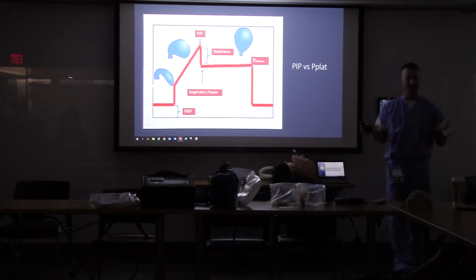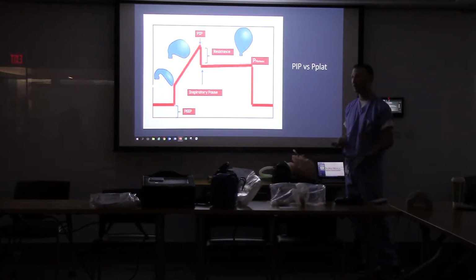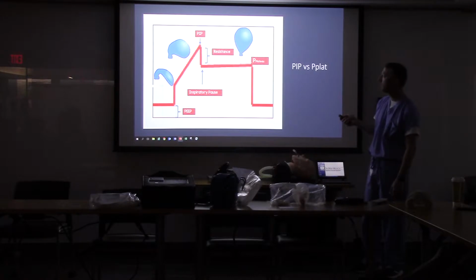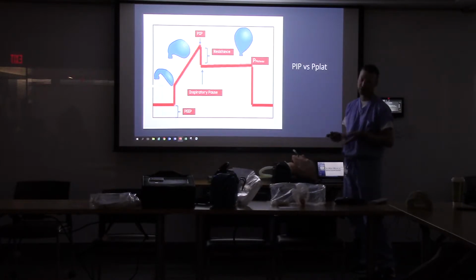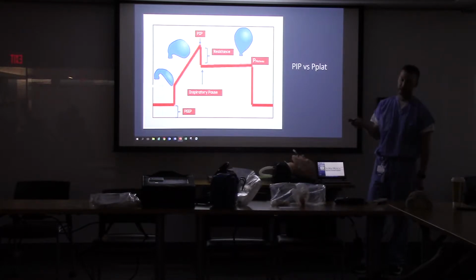But down past the bronchoconstriction, where the alveoli are, they're relatively uninjured, so they'll have normal plateau pressures, which is the pressure at the thin-walled, grape-like structure alveoli. So you'll have two different numbers, and you'll have to interpret: okay, this one's high, but this one's normal. What does that mean versus this is high and this is high?